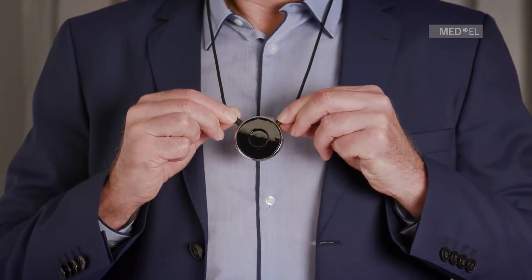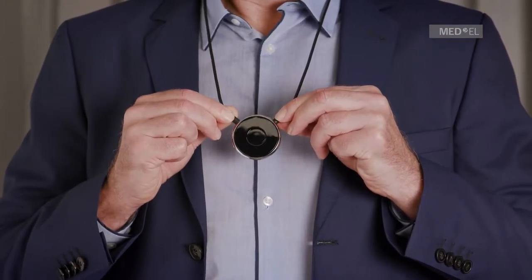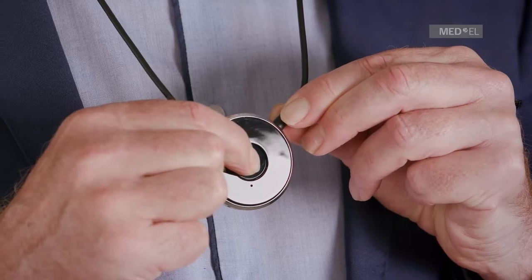Switch off your audio processor. Make sure your Samba2Go is switched off. Place it around your neck.